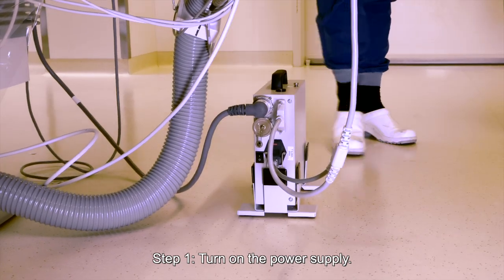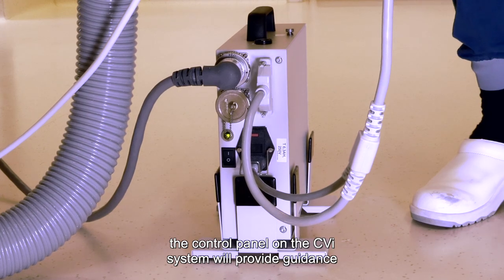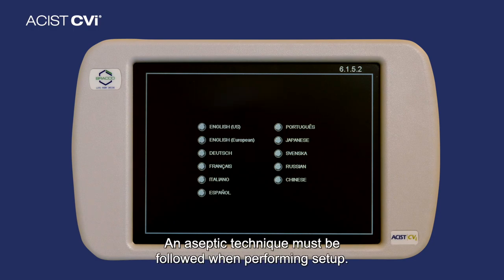Step 1. Turn on the power supply. After the system power is switched on, the control panel on the CVI system will provide guidance during the setup procedure by displaying on-screen prompts. An aseptic technique must be followed when performing setup.